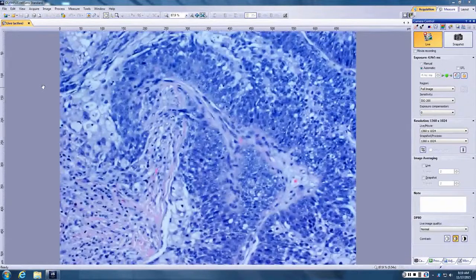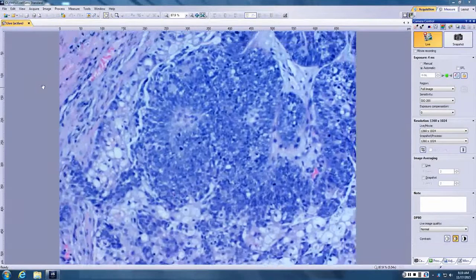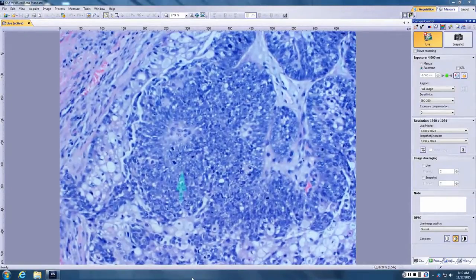I also see lots of mitoses and high nuclear cytoplasmic ratio and very large cells in the blue area and atypical mitoses. Sorry, we lost our signal there. There we go. Apologies to those online. So what would be a poorly differentiated sebaceous nodule with lots of mitoses and high nuclear cytoplasmic ratio? So sebaceous carcinoma. Another sebaceous carcinoma.